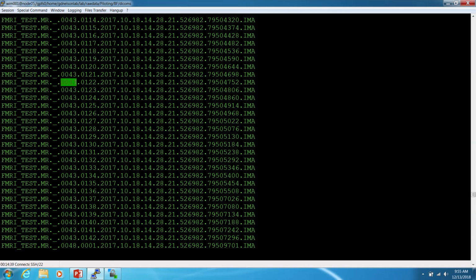And then there's this number here, and this is the series number, and that tells us the order that the files came in from the scanner. Basically, which thing was run first, which is really important when you have a bunch of files like this.